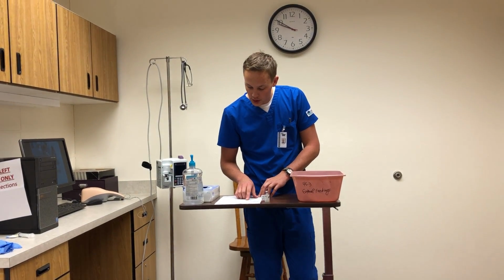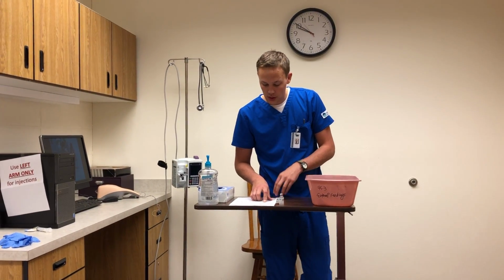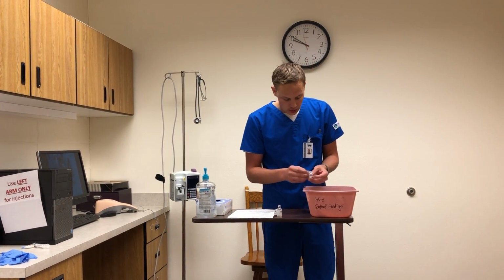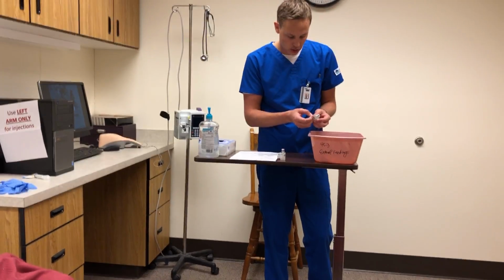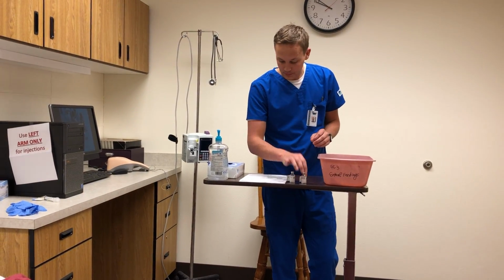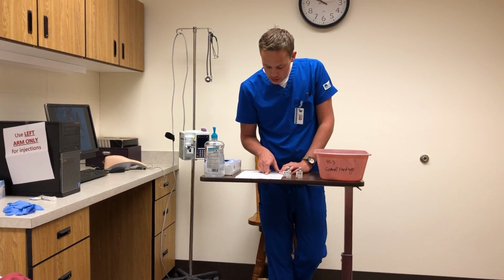And then next we have that regular insulin, U100 10 units subcut. Here's that regular 100 units per mL, 10 mL, and then it is Shirley Coast, 54 female, 5/14/1964. And then lastly is that Lispro U100 insulin pen.